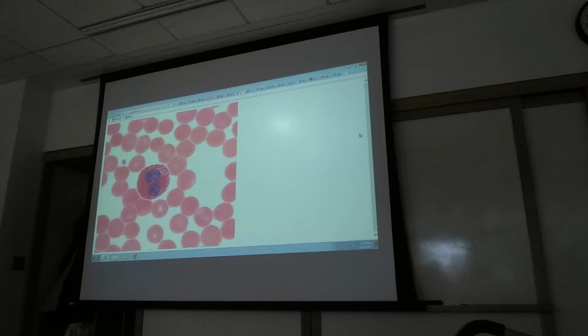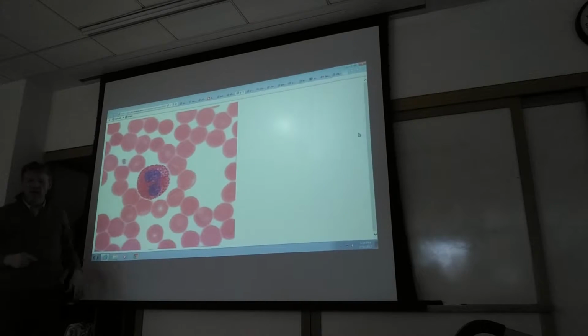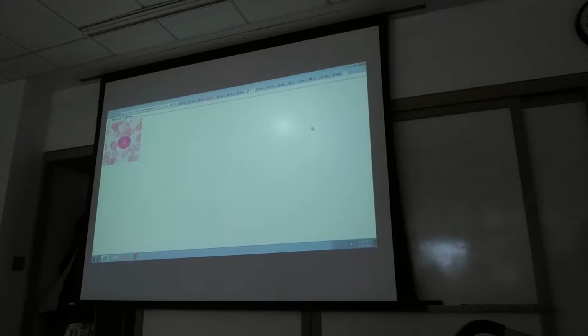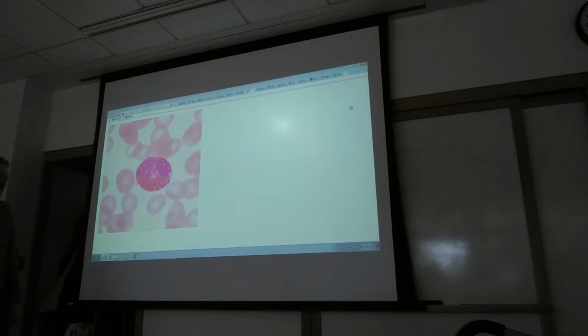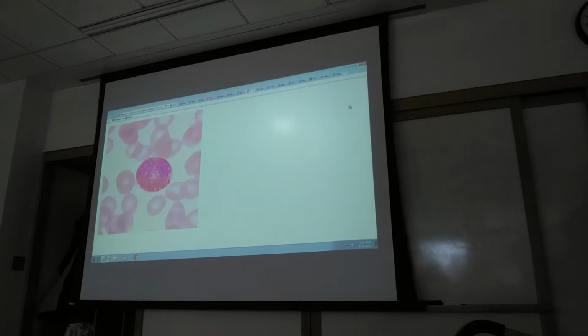The other thing with an eosinophil is it has what they refer to as a bilobed nucleus. Some people say it looks kind of like headphones, right? So you got the two headphone parts and then the little connector between them. But that's what the nucleus looks like on an eosinophil. Here's another picture. Again, fairly chunky red dots, and then this bilobed nucleus, think eosinophil.